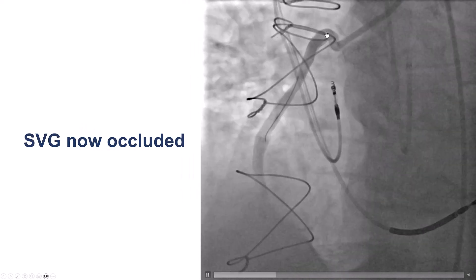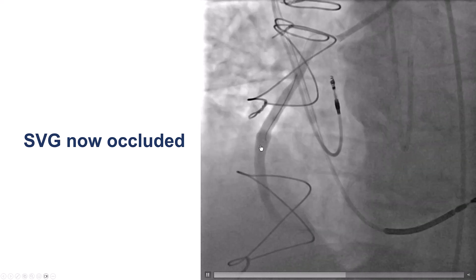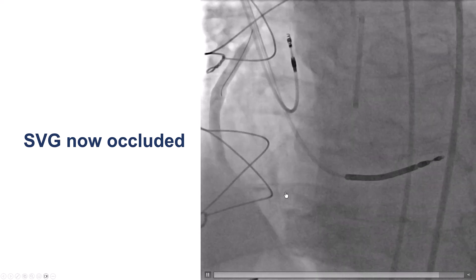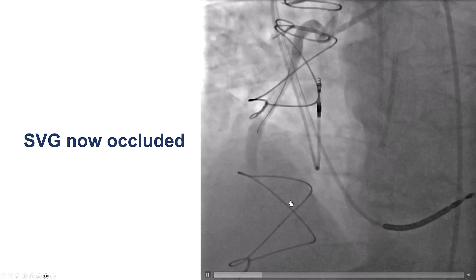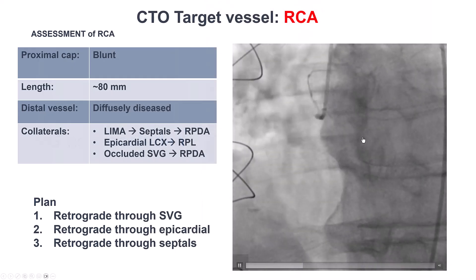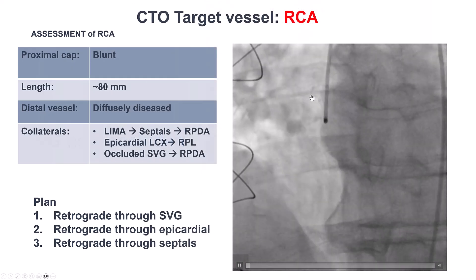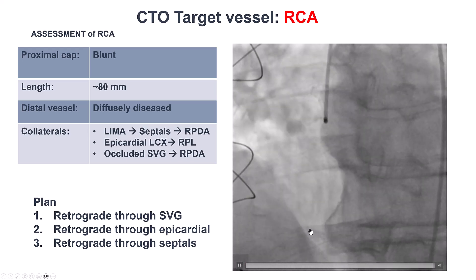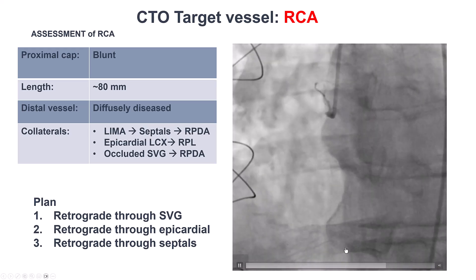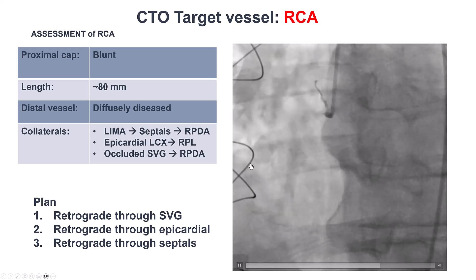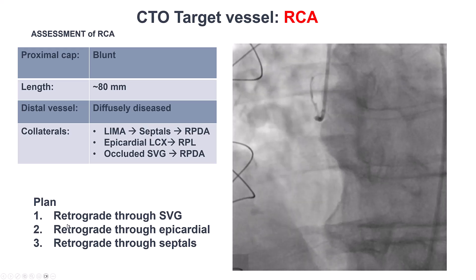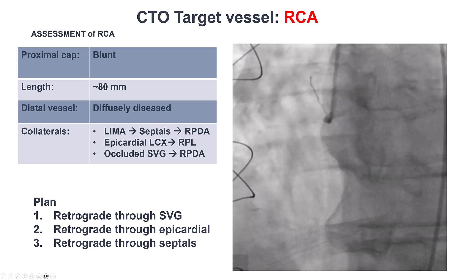The patient came back for the procedure and when we performed coronary angiography, we found that the bypass had now occluded. What we have here is an ostial RCA CTO with a blunt stump. The occlusion is essentially the entire length of the RCA, with reconstitution of the PDA and the posterolateral through epicardial collaterals. There is no filling through the vein graft now, but there are some septal collaterals.